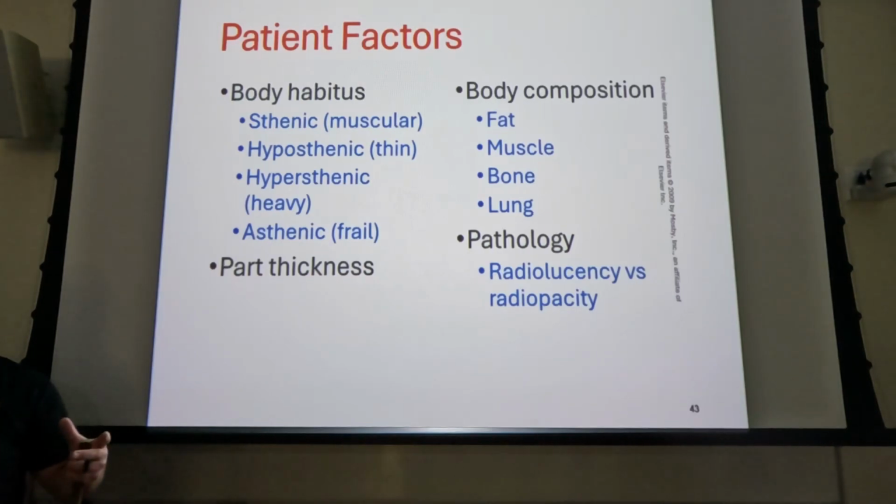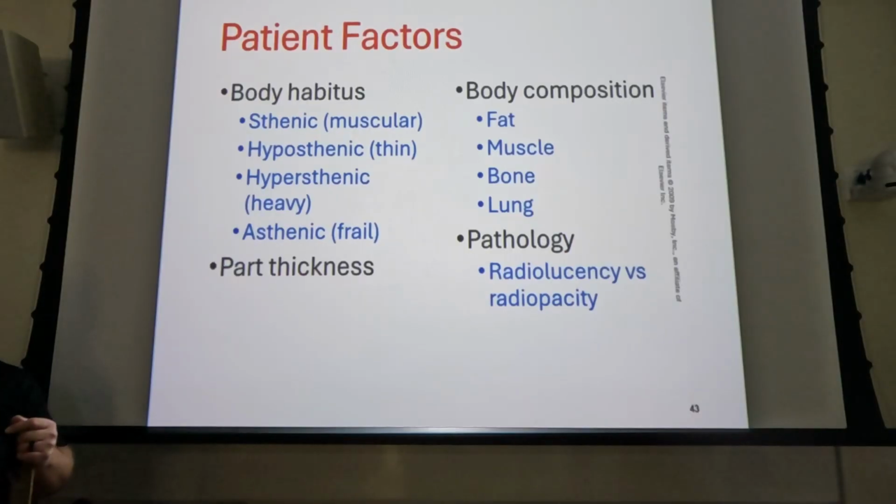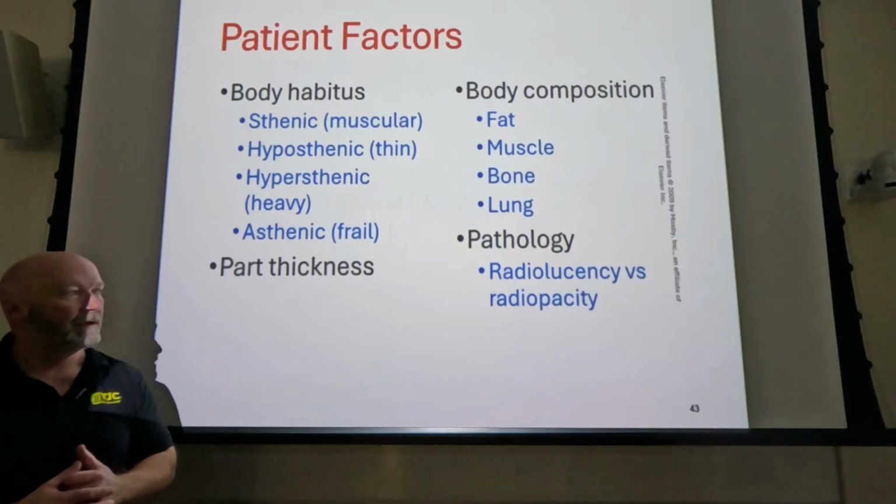It can't figure out what you did because you got all this dark area. So collimation becomes as important to the image as it used to be in reducing scatter radiation, but now it's because of the computation, the application of the computer algorithm to your image.